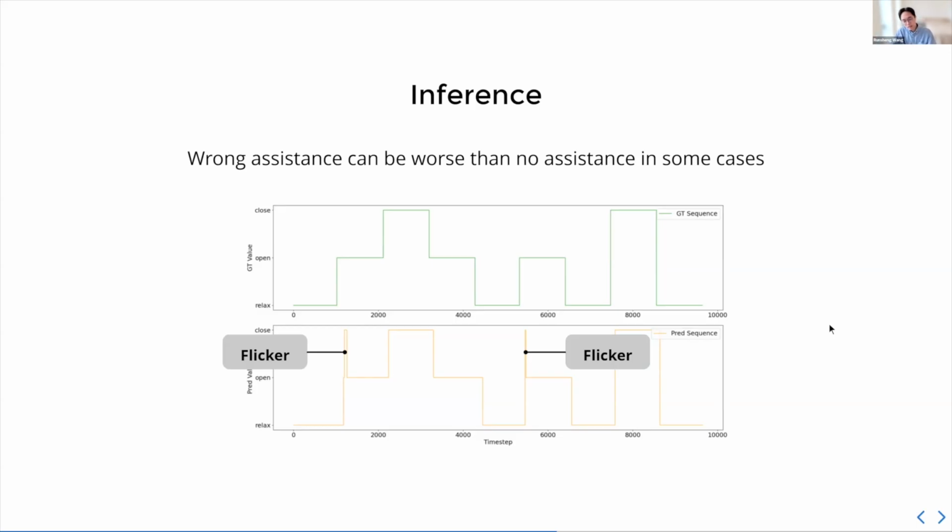This same logic applies to various wearable robotic setups, where you really have to follow the intent of the user. Any split second mistake can cost you a lot when you actually deploy the device. To summarize, wrong assistance can be worse than no assistance in some cases, and we really do not want these flickers to happen if we can. So we need some form of smoothing.